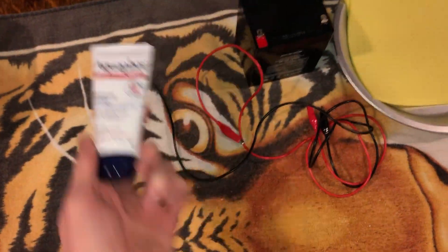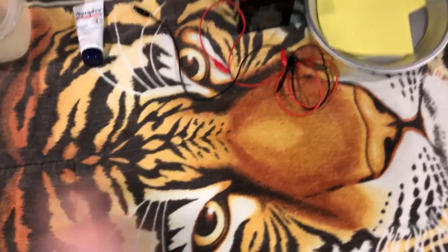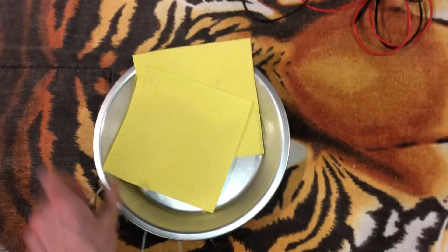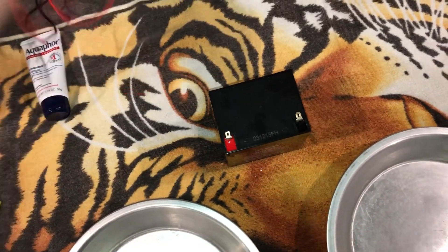You'll also need some aquaphor, some salt, and water. First thing you're gonna want to do is lay down a towel — doesn't need to be anything special. Take your aluminum pie pans and place them down, then get your 12 volt battery.